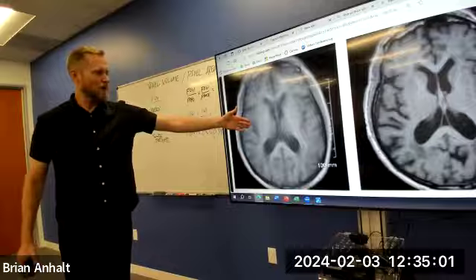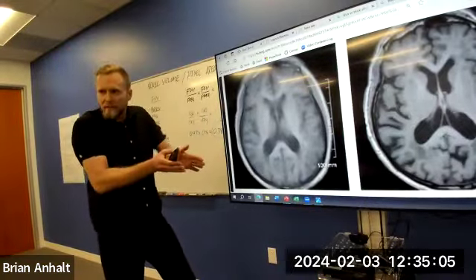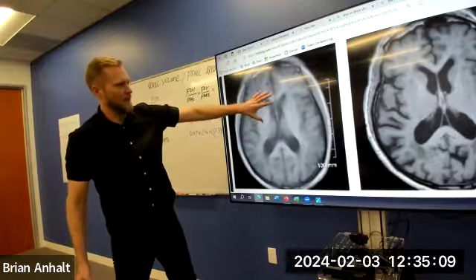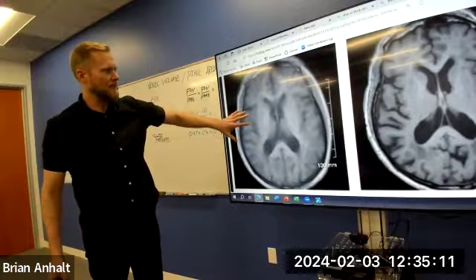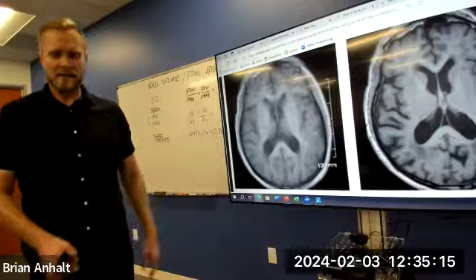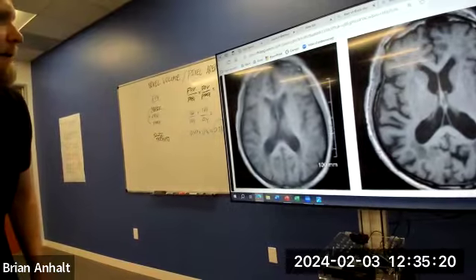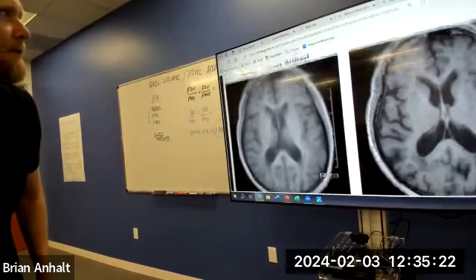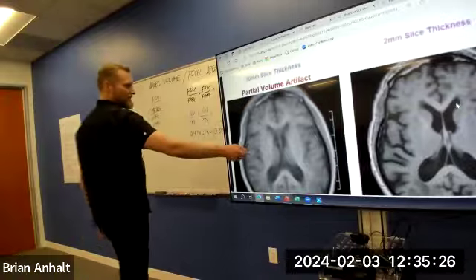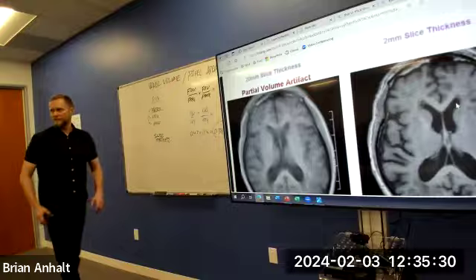This is called partial volume averaging. There's a lot of stuff that's over here that's getting averaged with the stuff up front. It gets all projected onto 2 dimensions. I'm seeing basically a ton of different detail all projected together into one 2-dimensional plane. And that is called partial volume averaging. And if we look here, I believe it's a 2 millimeter slice versus a 20 millimeter slice thickness. You can obviously see the difference, right?